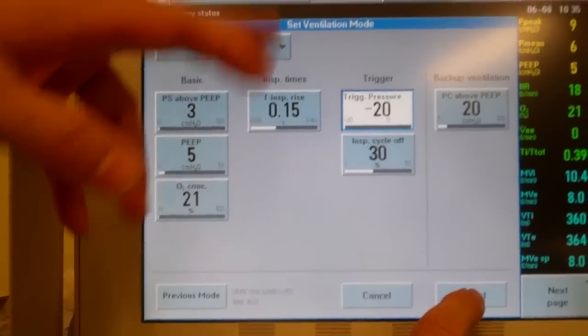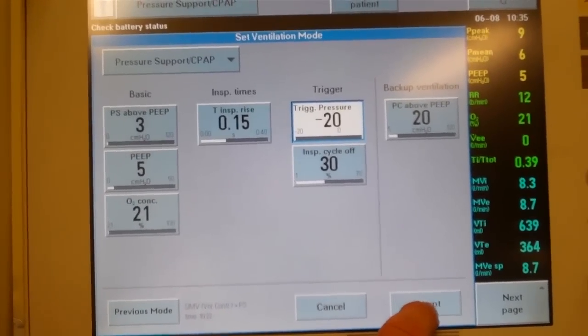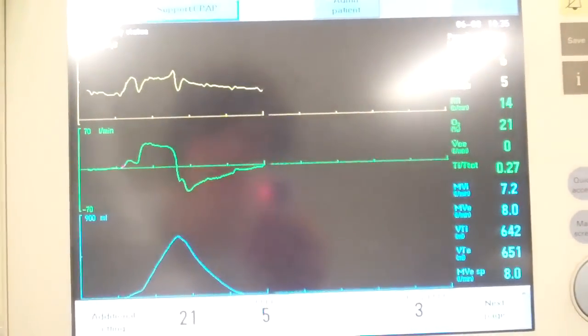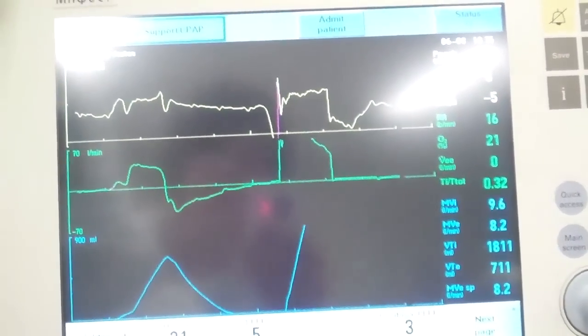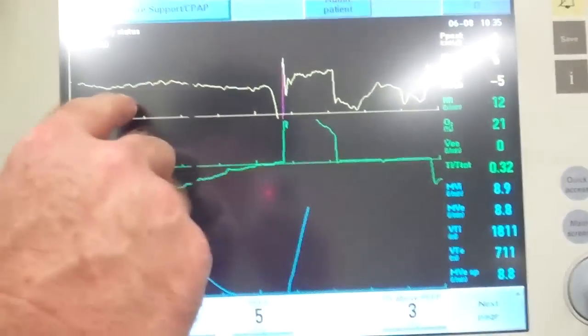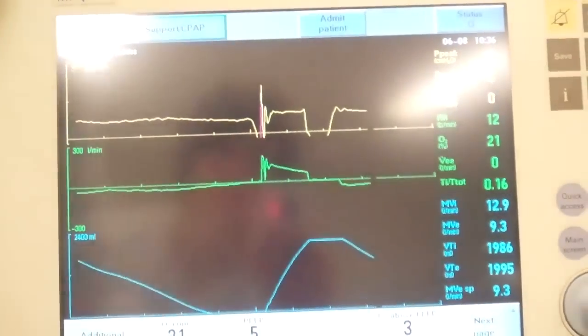So we'll watch this monitor very carefully as we're talking and coaching our patient. Okay, Mr. Dunphy, we want you to pull in a nice deep breath — pull as hard as you can. Pull. There we go. Let it out. And then try to pull in one more time. Deep breath. Pull hard. There we go. There's another trigger.